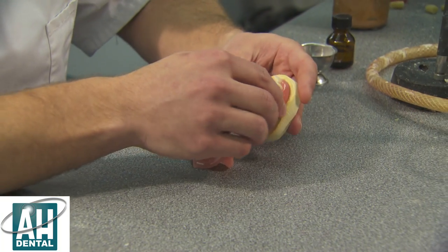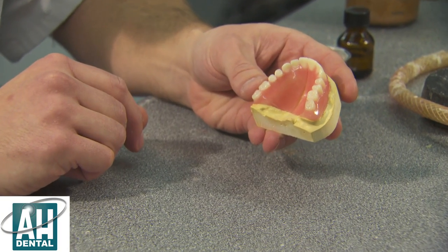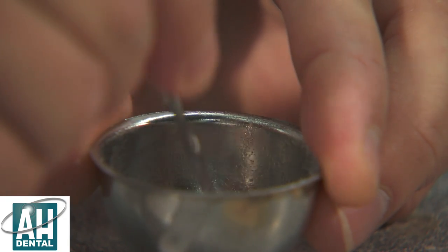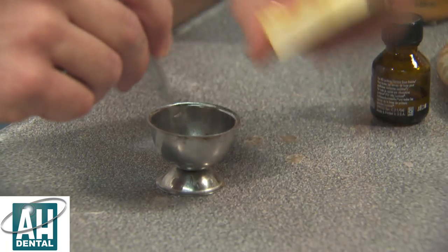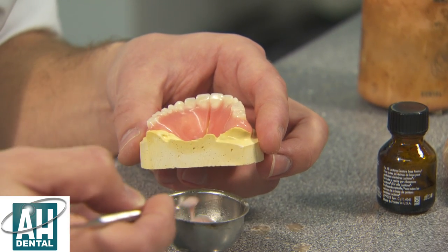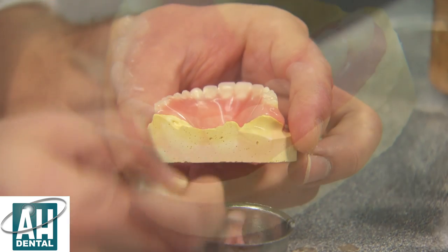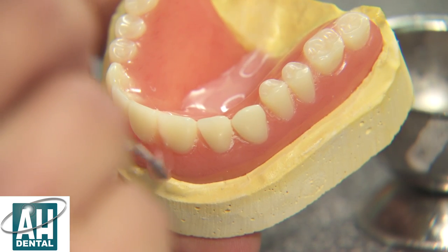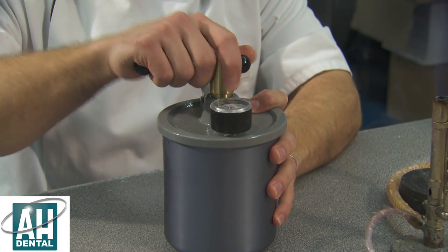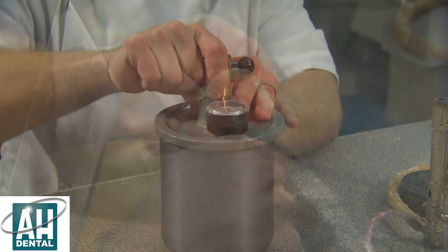Now the isolating solution is dry, we can put the two halves of the denture back on the model and mix up some repair acrylic to go in that groove. The denture has been cured in the pressure flask for 10 to 15 minutes, so it's now ready to be trimmed up.